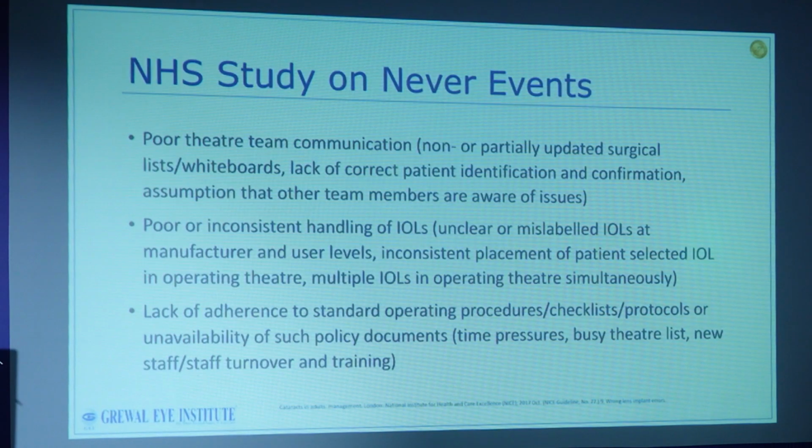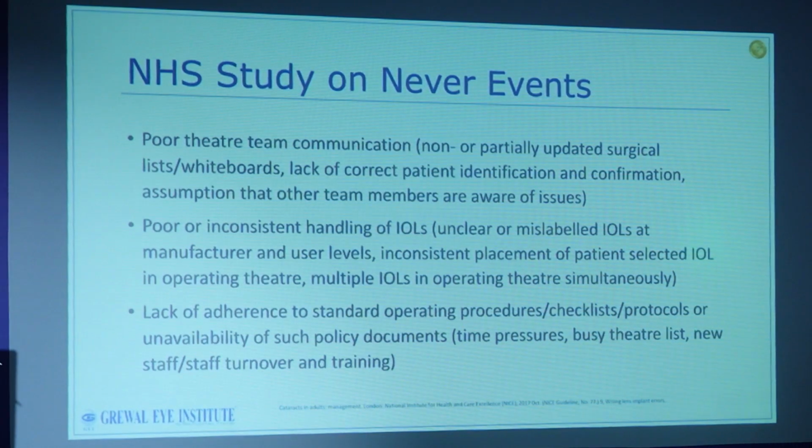Within the OR, there can be poor communication between different staff members, leading to errors. IOLs, maybe someone picked up the wrong IOL. And even if you impose protocols, it's very difficult to make sure everybody is following them. So there are a lot of chances of errors that can happen and which can affect the patient significantly.